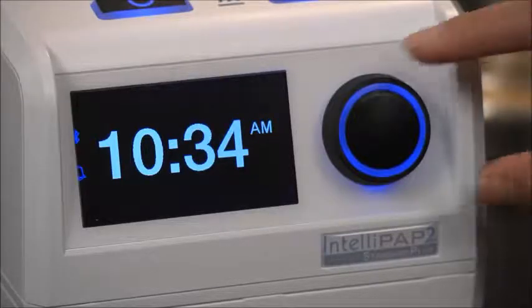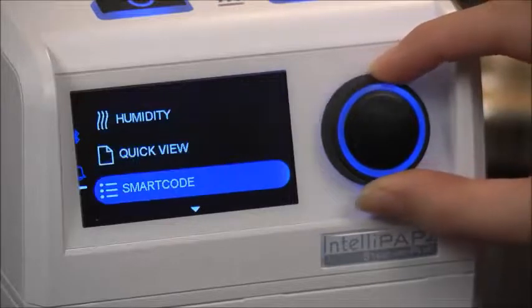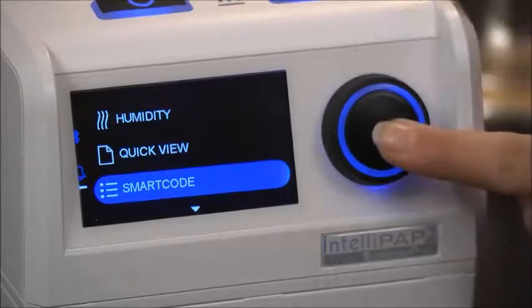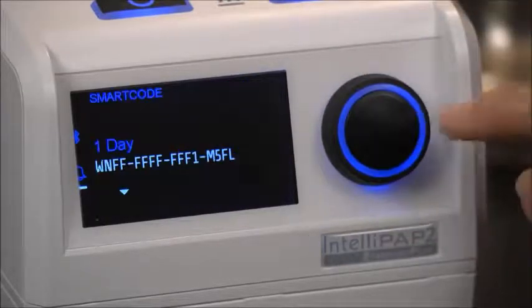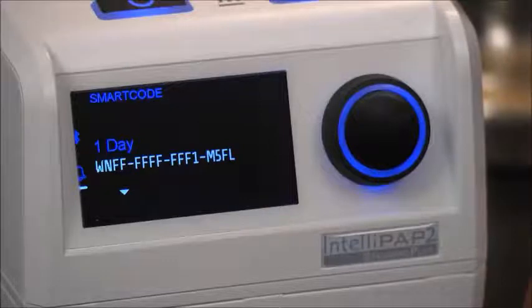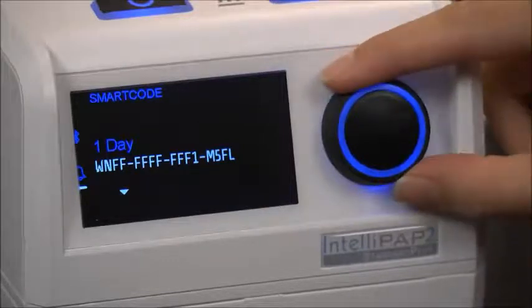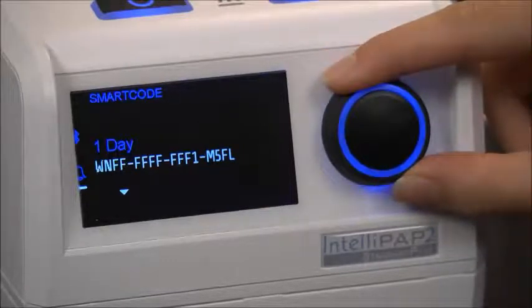First, highlight SmartCode by turning the rotary knob and press to select. The 1-day data set will appear. Continue to turn the knob to view the additional screens.